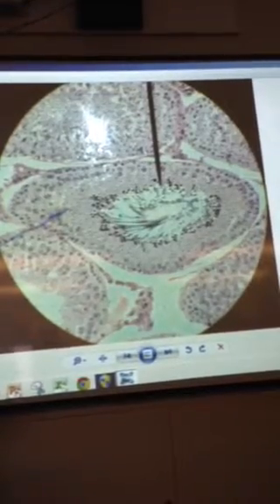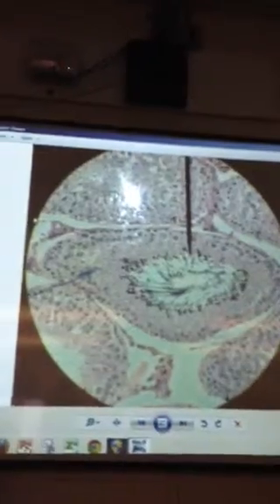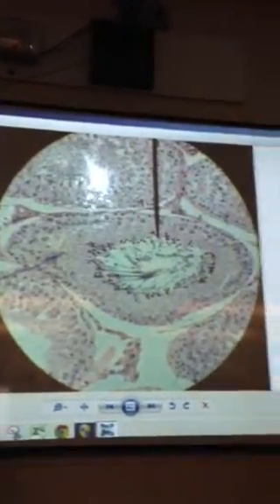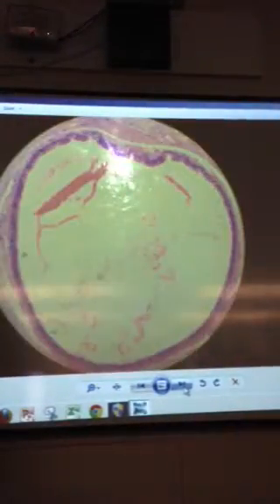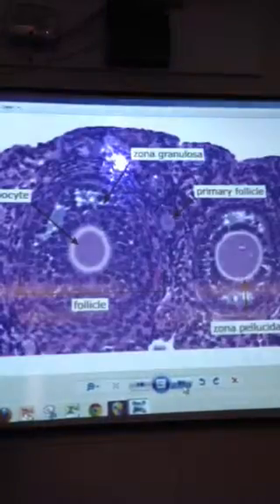You don't have to identify the nerve cells. I am not good at identifying the nerve cells. They're large cells, a lot of cytoplasm, large nucleus, and I've never seen one that I could say definitively this is a nerve cell. All right, now these are not in any order, so let's see what comes up next. Spleen, respiratory, we keep moving.